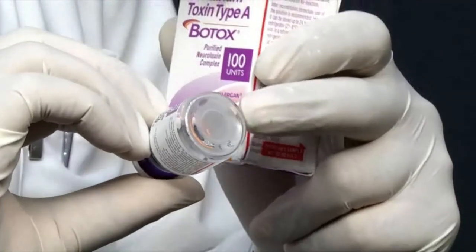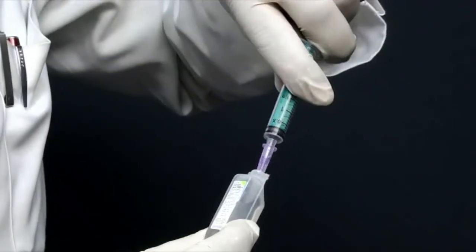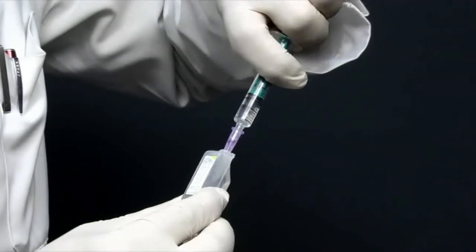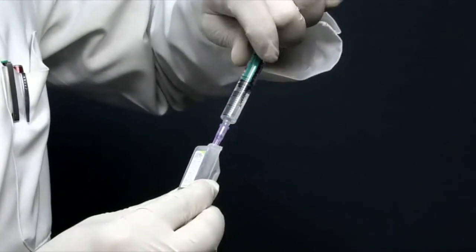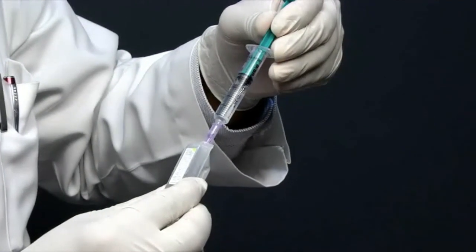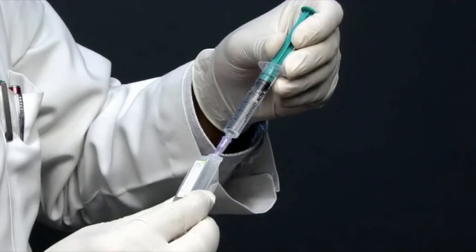When you reconstitute, the powder will dissolve and form a clear solution. I have a preservative-free normal saline with me and a 2 cc syringe, and I am going to draw the preservative-free normal saline into the syringe so that we can reconstitute our Botox. We are reconstituting with 2 cc's of preservative-free normal saline for a 100 unit vial, so each 0.1 ml is going to contain 5 units of the drug.